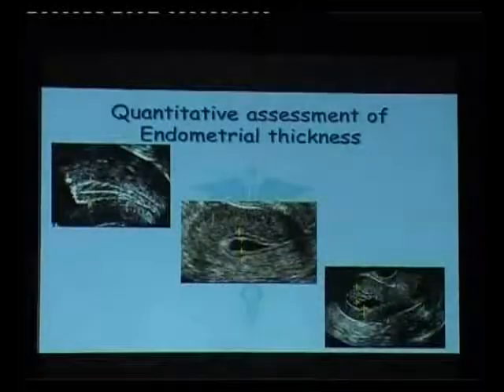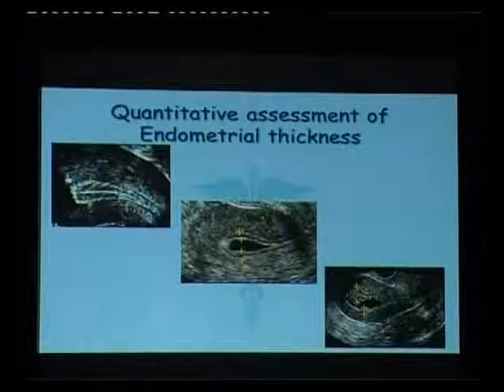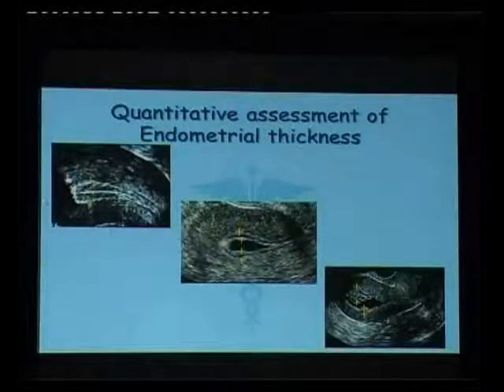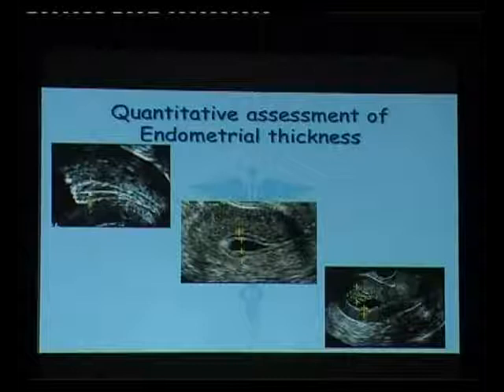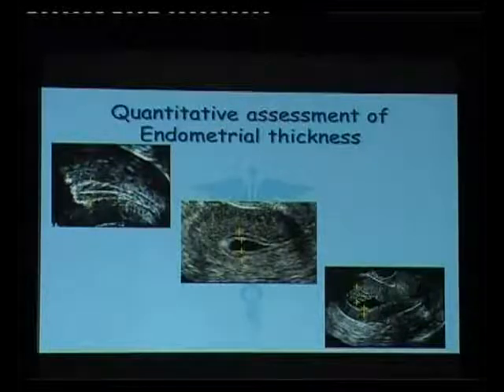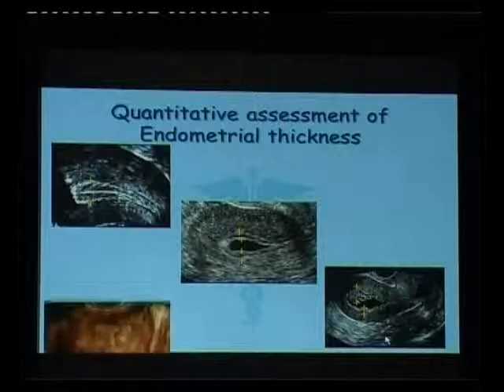So these are typical examples where we have a magnified image of the sagittal section of a transvaginal uterus, where we could find that the endometrium is very clearly delineated. You need to take the thickest part and measure with the opposing calipers just perpendicular to the endometrial line. Whenever there is fluid, you try to add the anterior and posterior thickness. And whenever there is irregularity also, you do the same thing.